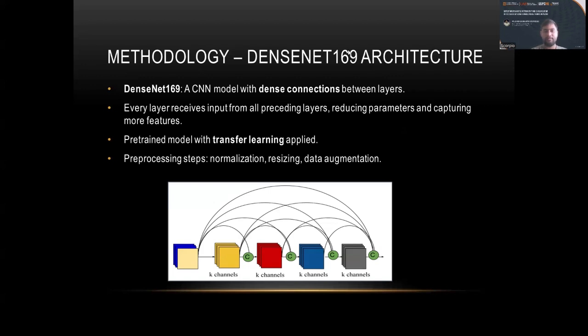These include randomly flipping the images, rotating them, and occasionally zooming in on certain areas. Augmentation helps the model learn to recognize diabetic retinopathy patterns under different orientations and scales, making it more robust to variation in real-world images. It also artificially increases the size of our training dataset, further reducing the risk of overfitting.